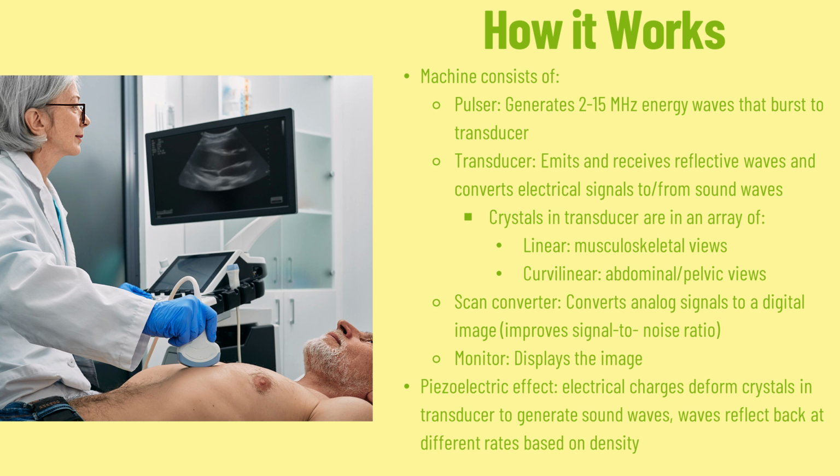That transducer is there to convert the sound waves into the analog waves. And then we go into the scan converter. The scan converter is going to convert those analog images into digital images and clean up the picture a little bit more. And then lastly, we go into the monitor or the display, which is what we are viewing the ultrasound through. Now, the ultrasound is a real-time imaging system, so you can actually move the image to get a better idea of what you want.